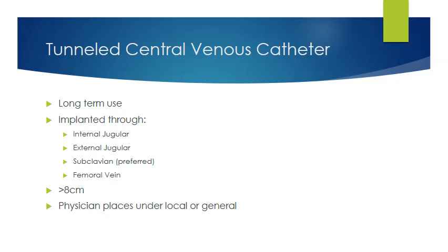Again, this one is the same as the non-tunneled with the greater than 8 centimeters, and that's going to depend on the patient's size again. I think your book might say that they're usually greater than 90 centimeters, but I'm not sure on that number. Physicians will place these. They can be under local or general anesthesia. They are usually done in surgery. These are not done at the bedside. This is a surgical procedure.